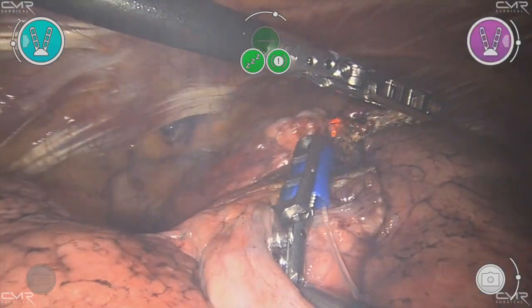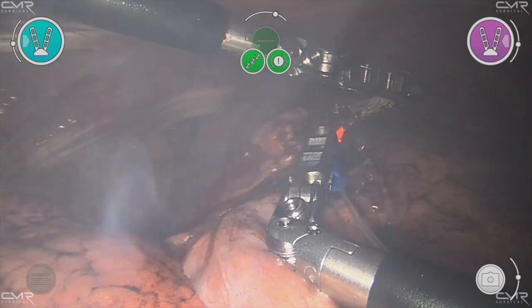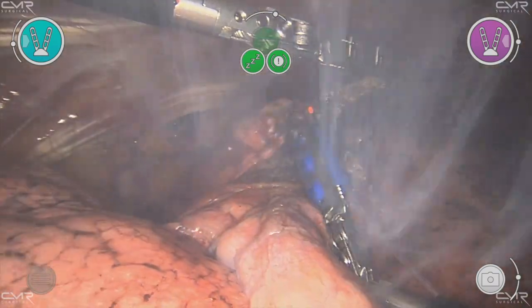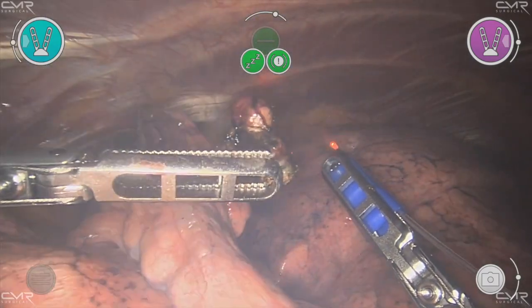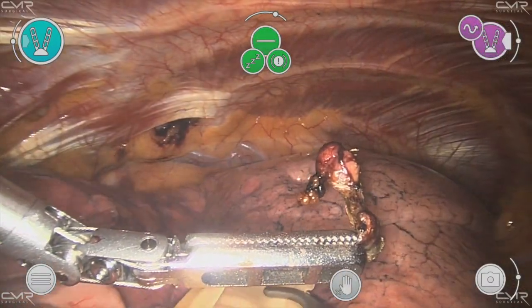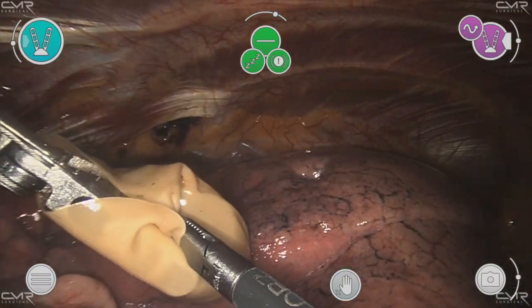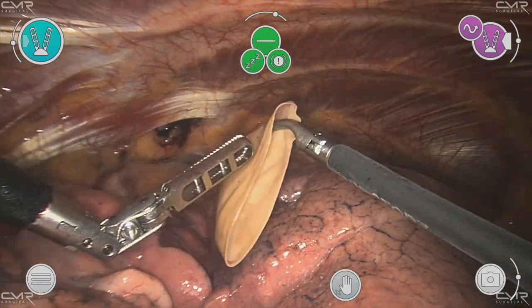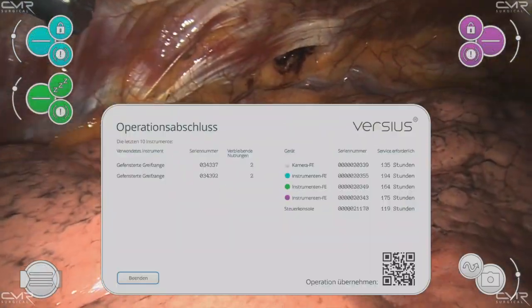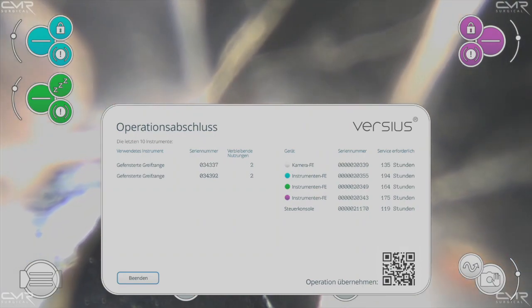Sven's making a real success of that in Chemnitz. So we're just coming to the end of the dissection section here - great job again everyone in Chemnitz. Watch out for more videos. Sven's operating every single week in the chest, doing a wide range of operations, and we'll hope to bring you as many of these by video as we possibly can. So there's the resected nodule, very nicely shown there, and we can now simply take that out in the finger of a glove - the thumb of a 7.5 Biogel glove - and that can be very easily removed through even a 5mm port. Great job Sven and the team. Well done. Look out for more videos in this series. My name's Joel Dunning - it's been a pleasure to bring you this fantastic operation.